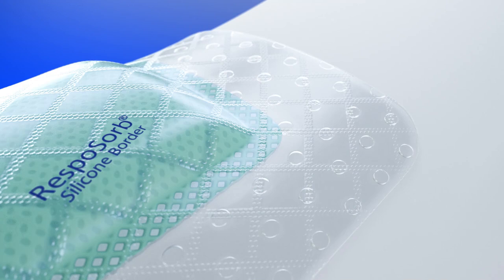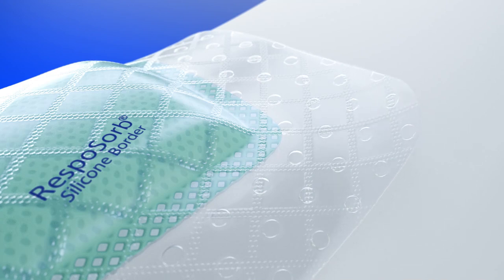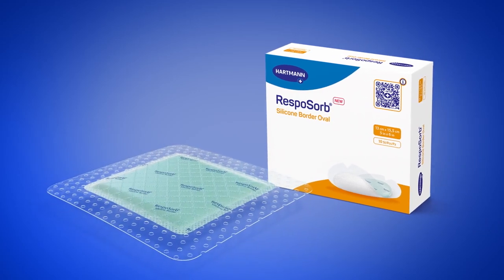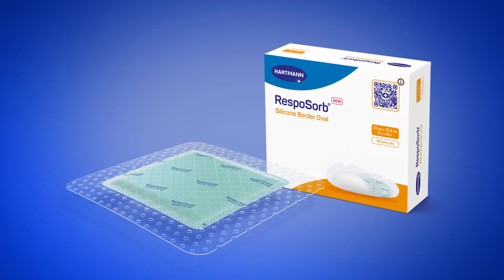The specially designed silicon contact layer allows atraumatic dressing changes as well as repositioning of loosened edges. Step up to a new generation of wound dressings with Resposorb Silicon Border.